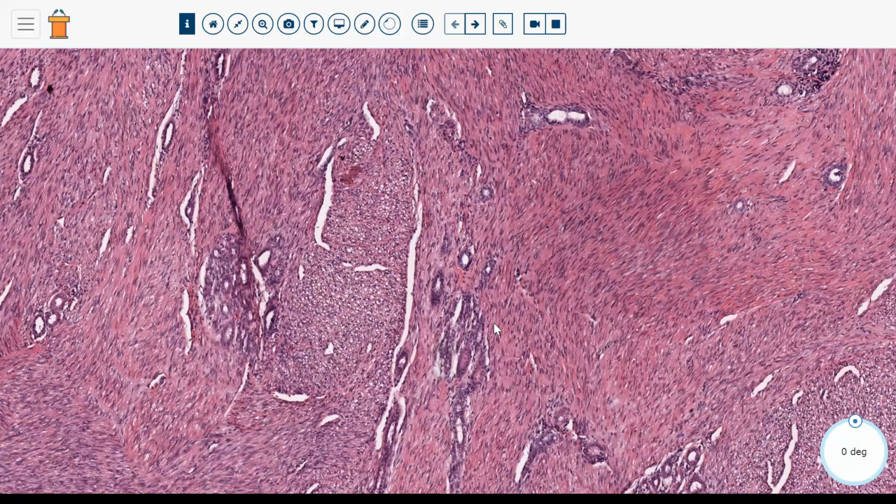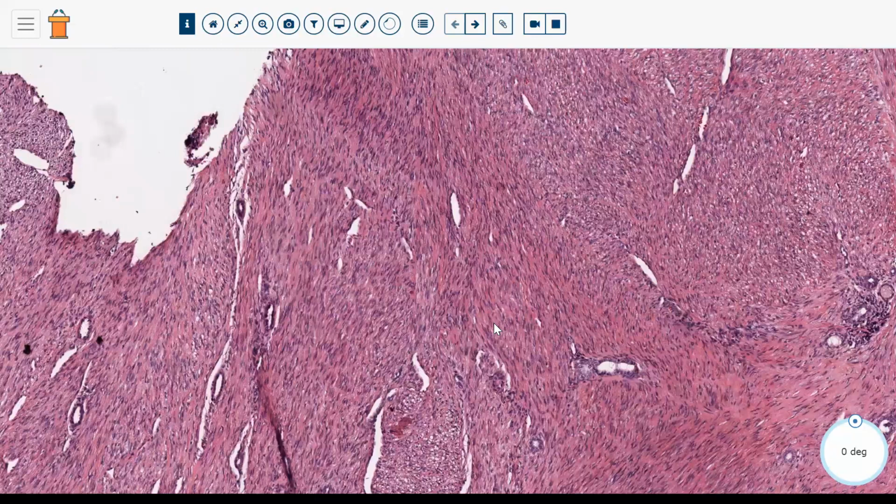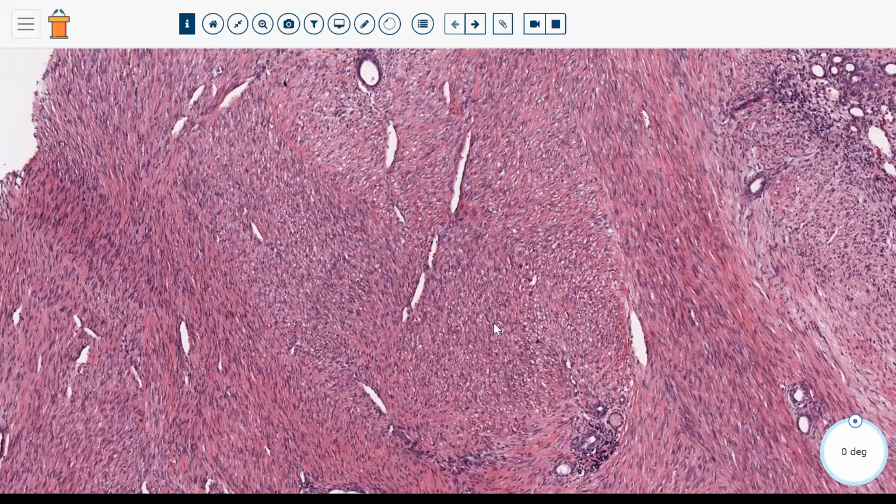Curiously, the cellular type of congenital mesoblastic nephroma and infantile fibrosarcoma share the same gene rearrangement, a translocation between chromosomes 12 and 15, t(12;15), involving the genes ETV6 and NTRK3. This is a really interesting gene fusion in that it's been recognized in several other tumor types. We've got mesoblastic nephroma and infantile fibrosarcoma, which both share that same fusion.